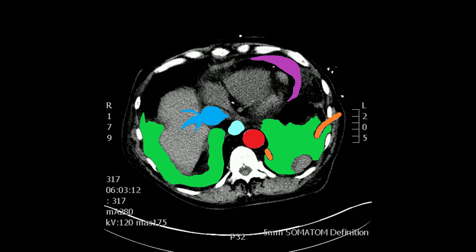The inferior vena cava is now detached from the right atrium. We have a left and right pleural effusion — the orange left pleural catheter and in purple the pericardial effusion. In red, the descending thoracic aorta; in light blue, the esophagus; in dark blue, the inferior vena cava with the hepatic veins draining into it.